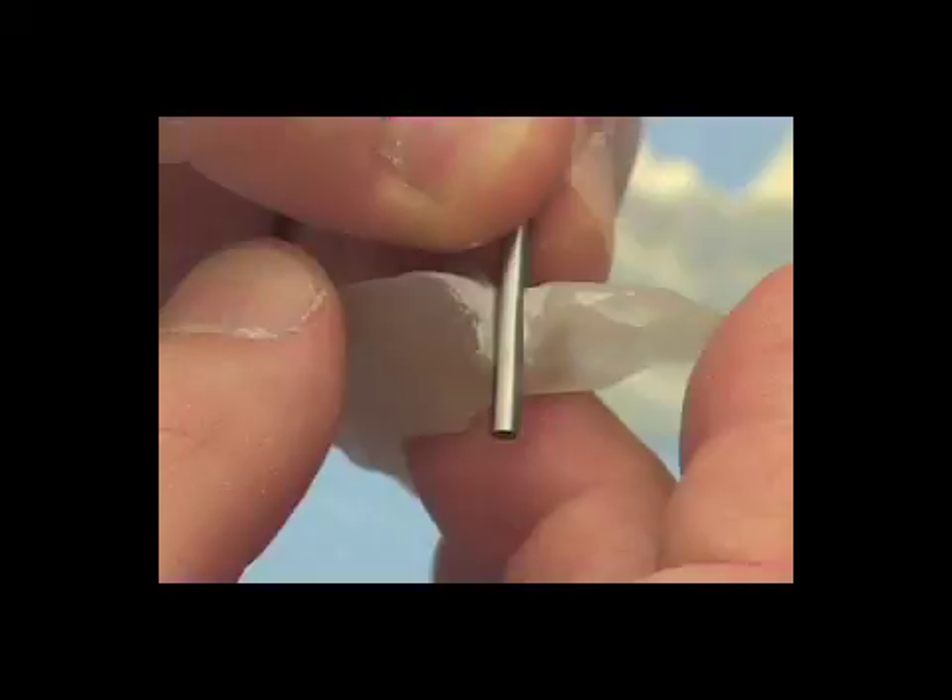This completes the fabrication of the 2.8 millimeter drill guide. We're not going to show on film the fabrication of the 3.5 millimeter drill guide, but it's done in exactly the same fashion.